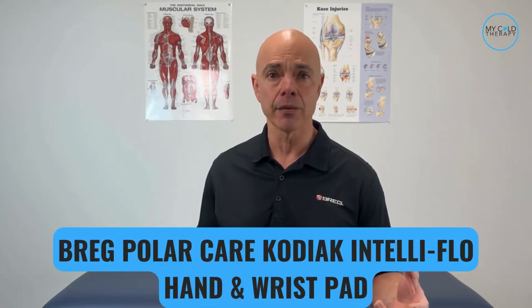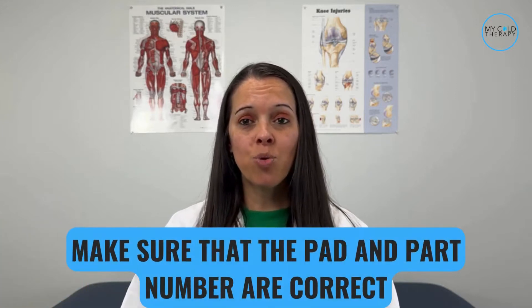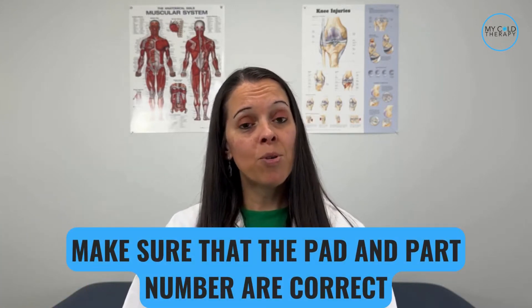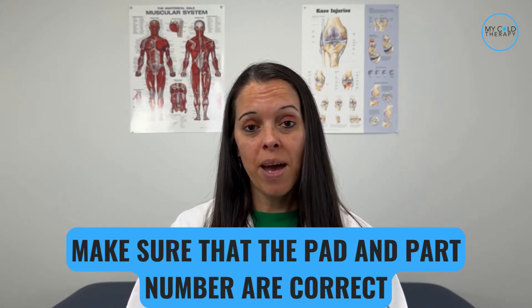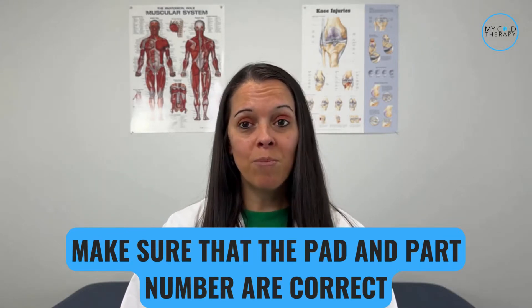Michelle, take us through the steps of the application of the Breg Kodiak Intel Flow pads. The first thing we need to do is make sure that the pad and the part number are correct. You would do this by looking at the front right corner of the pad where the part number will be listed on the white label.